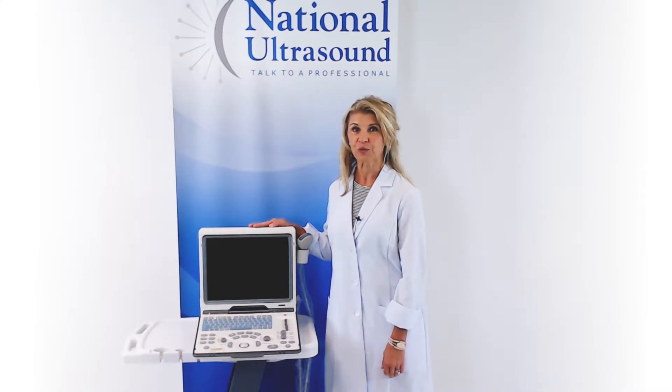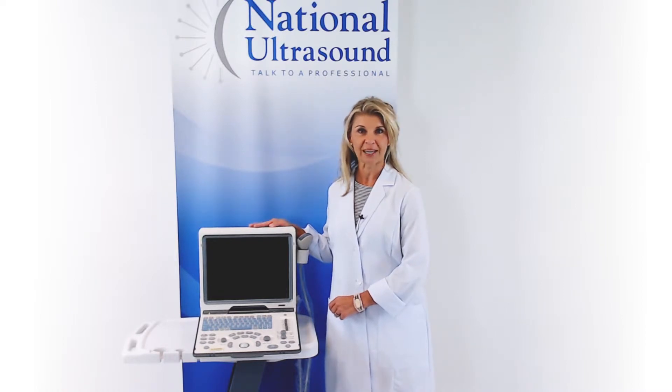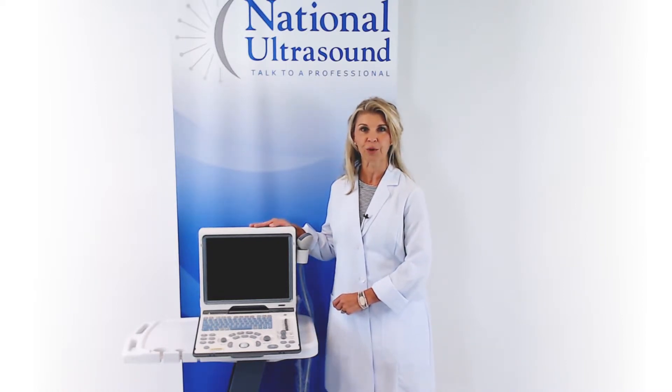It is best used for general imaging, MSK, needle guidance, and basic OB/GYN applications where color flow Doppler is not required.